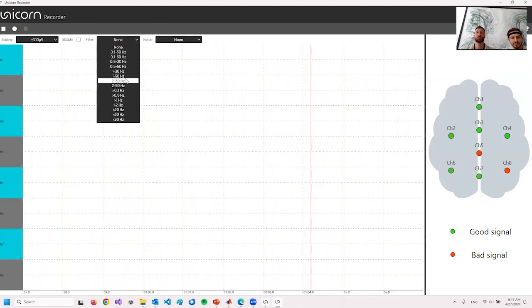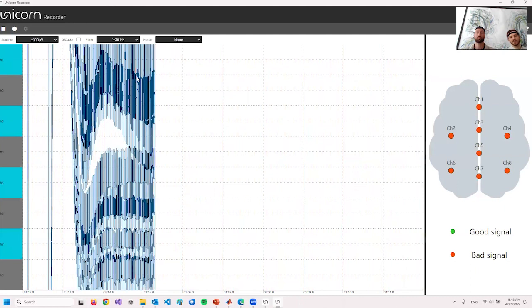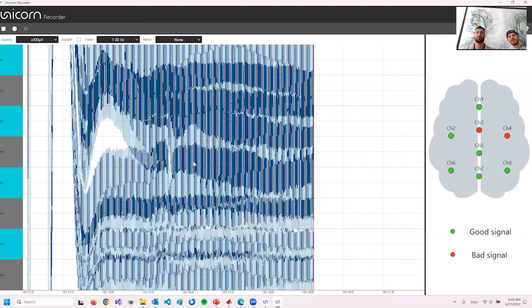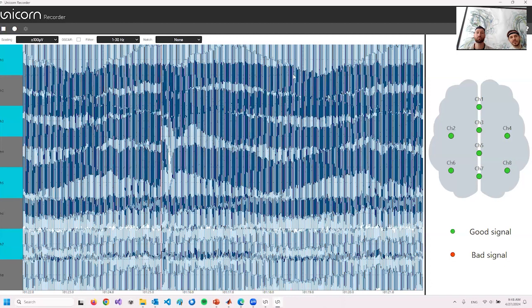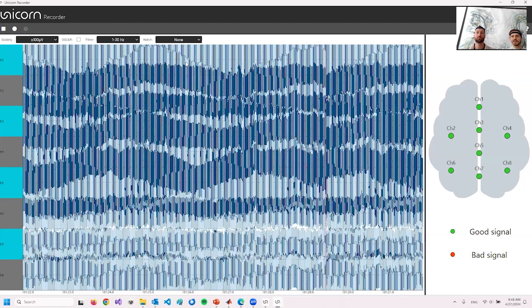I'd first apply a bandpass filter to keep the frequencies from 1 to 30 hertz, for instance. And now you can see that the signals are no longer floating and they are located around 0 volts, but you can see that there is a lot of noise, and that's the power line hum that we can still see here.